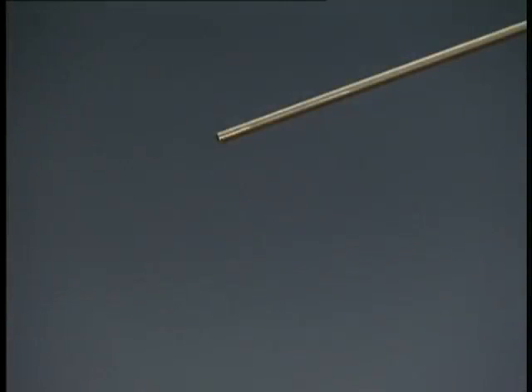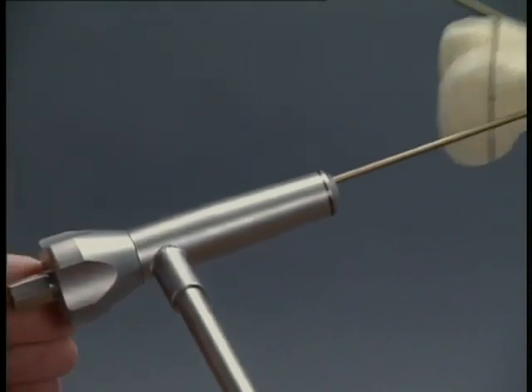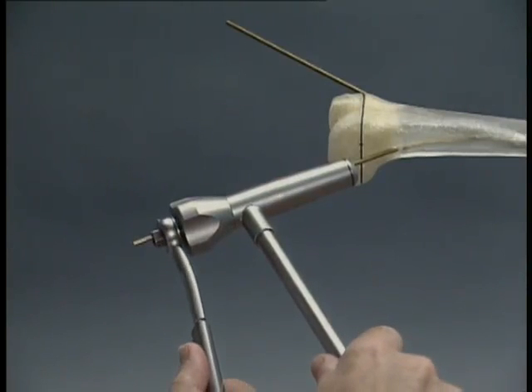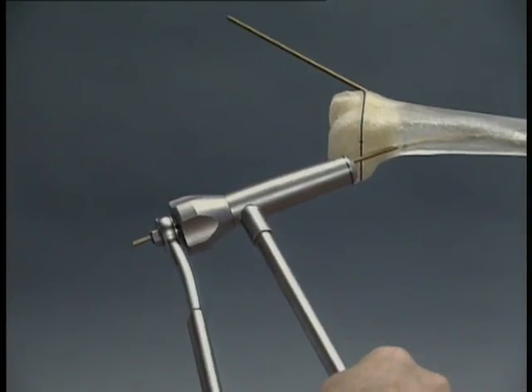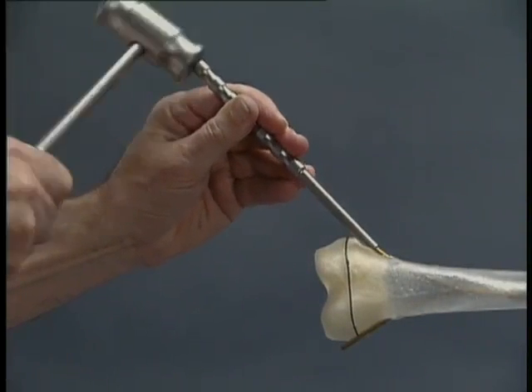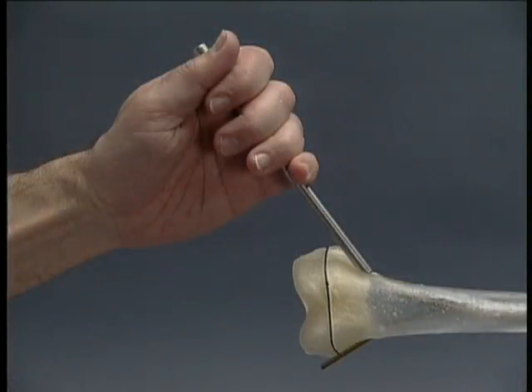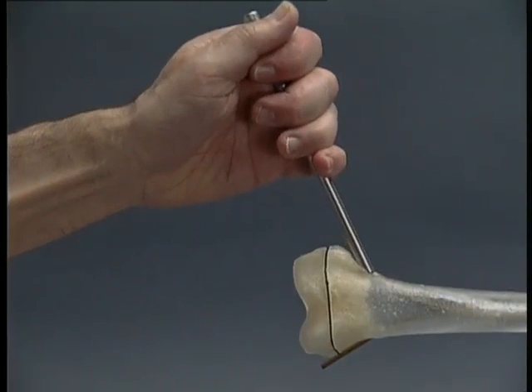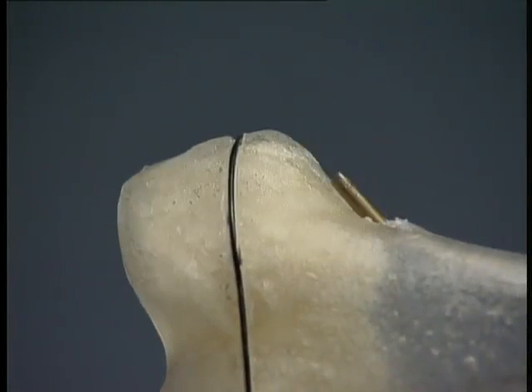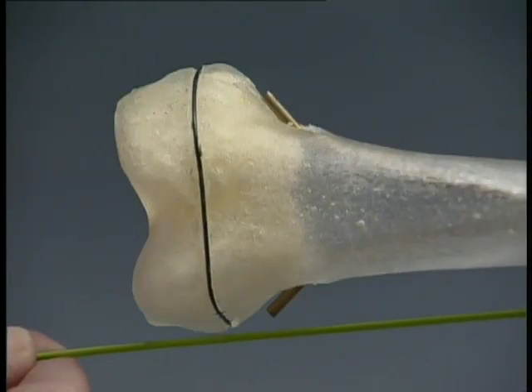With the nails in position, it is recommended to shorten them to the required length using the cutting instrument, inserting the end through the appropriate marked opening in the cutter sleeve. Care must be taken to ensure that after the final position is reached, the ends do not protrude too far. Using the beveled impactor, the nails are brought into the planned anchorage position in the proximal metaphysis with gentle hammer blows, with the beveled part reaching the cortical bone, guaranteeing a projection of about one centimeter. The ends are bent slightly upwards to make later removal easier.